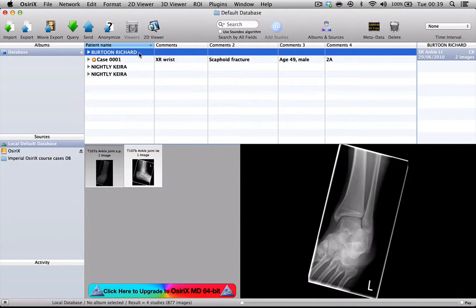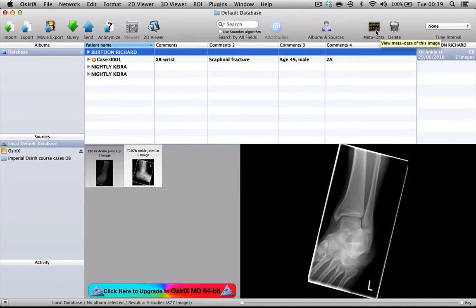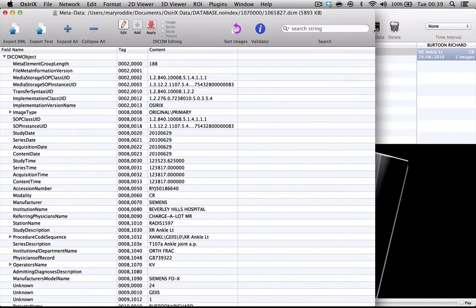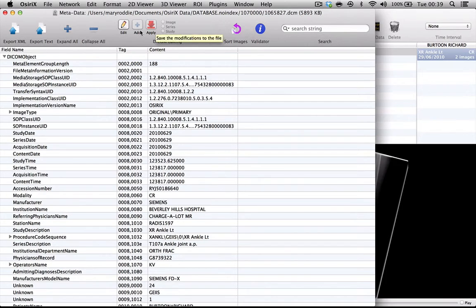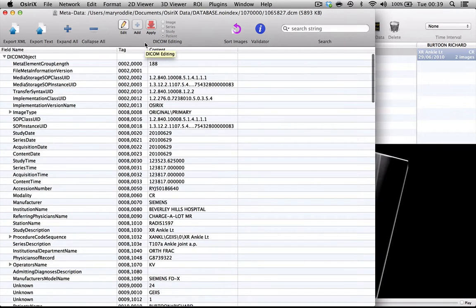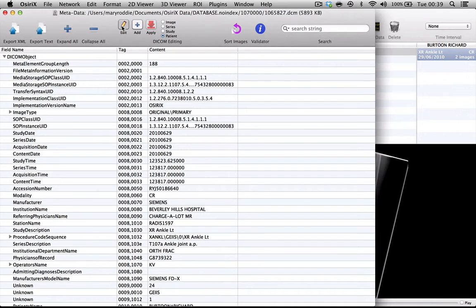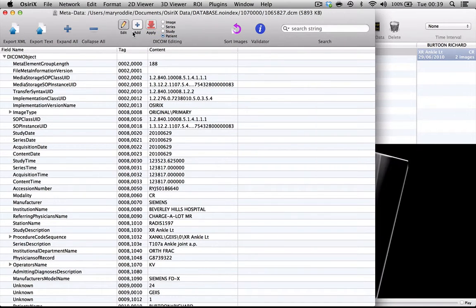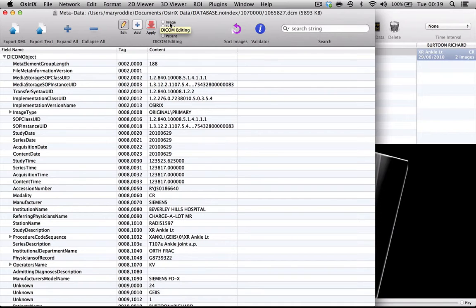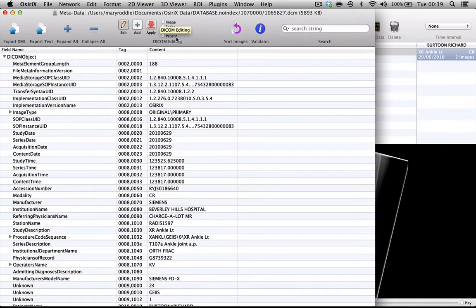For the next case, let's look into directly editing the metadata. I've highlighted the case and I'm now going to open up the metadata list. This time, rather than just reading through all the lists, I'm going to highlight and activate the editing tool. You can see that this little plus becomes positive, and that means I can now edit the DICOM data. I want to do it for the study, although I could choose to do it either for a single image or for a whole study or for a series or for the patient. In this case, I'll select study.